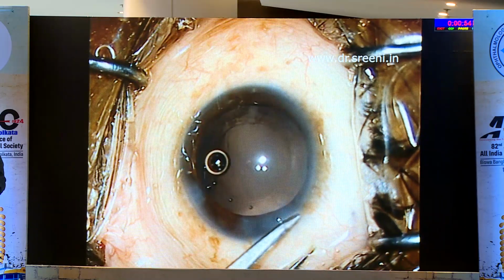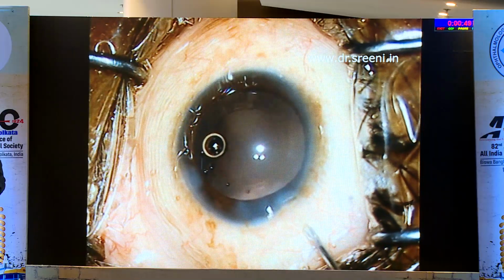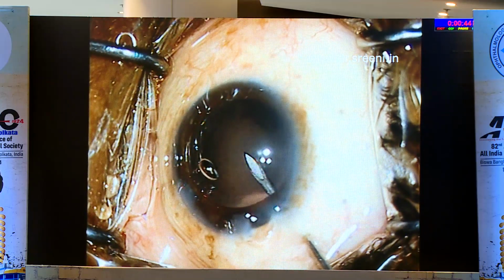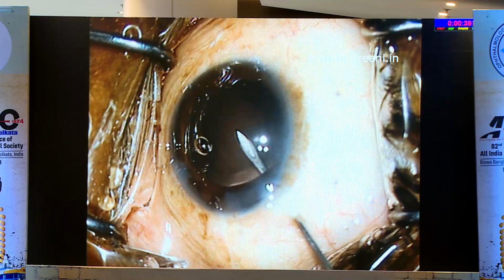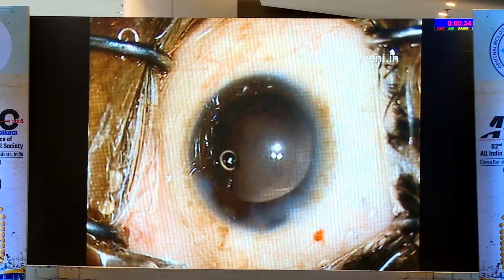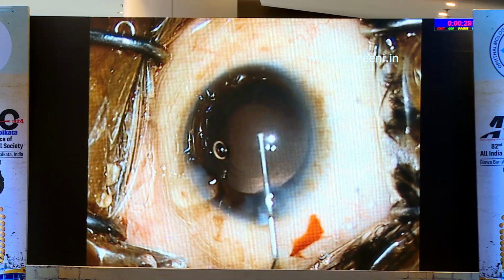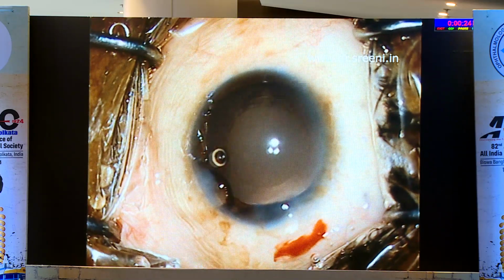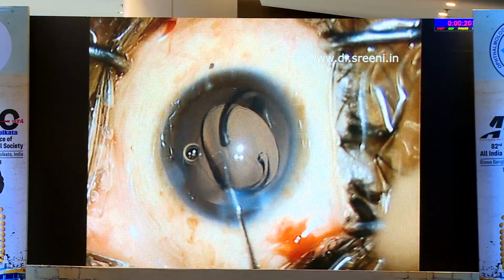So this is another case. Same thing happened. So it's happening quite frequently for me. So it went through the pars plana. Again, you're not going posteriorly. The attempt is to go to the space just behind the PC and aspirate the fluid. So you don't need to aspirate also. Just keep it, the fluid comes out if it is the fluid that you have hit. So again, it goes back and the IOL can be implanted very comfortably.